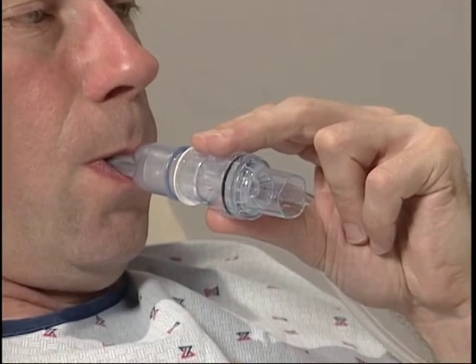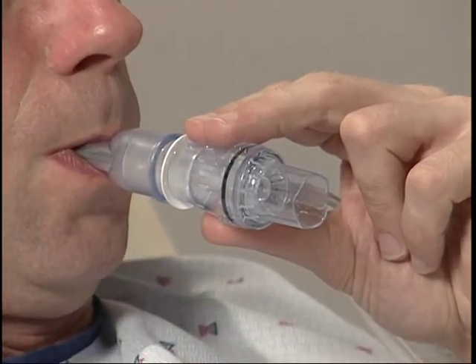EZ-PAP is intended to be used on an intermittent basis and not for extended periods of time. EZ-PAP can be used with a nebulizer to provide simultaneous aerosol drug delivery while performing therapy for lung expansion. Studies have shown a significant improvement in forced expiratory volume in the first second and in forced vital capacity.